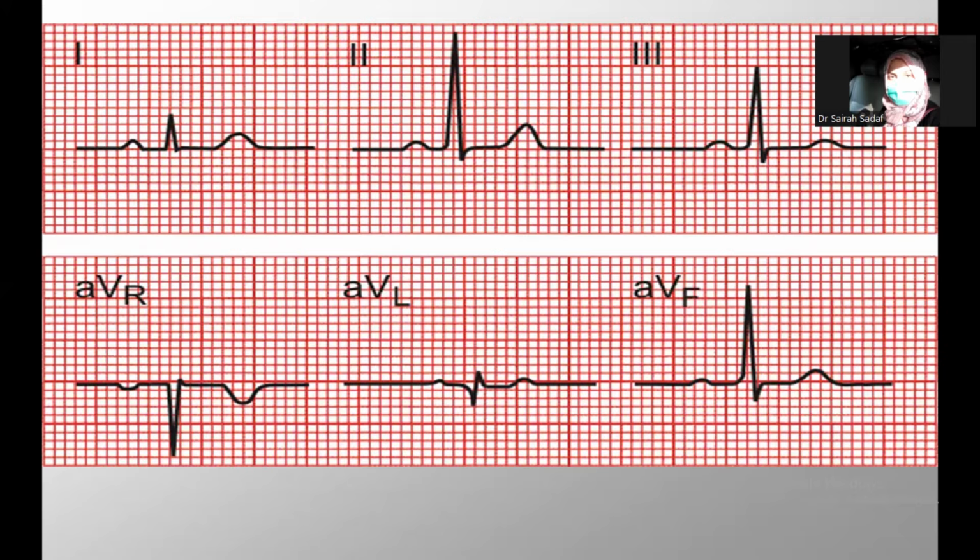So anyways, who will tell me that lead 1 represents which side of the heart? Remember, I have already showed you that slide and I have asked you to memorize it. Have you memorized it yet? Who will tell me? Left, very good. So, as lead 1 reflects the electrical activity on the left side of the heart, it means that it should always be positive.